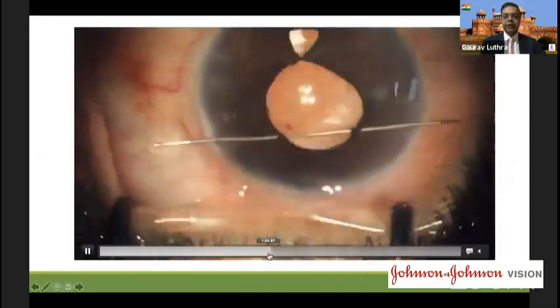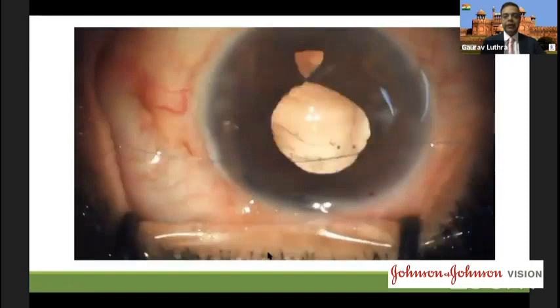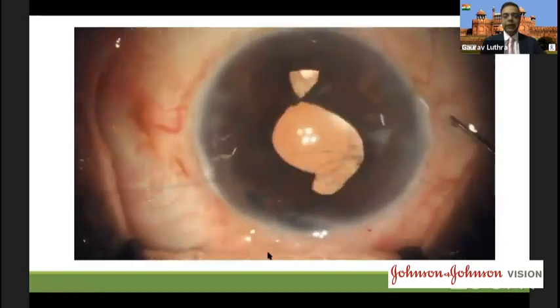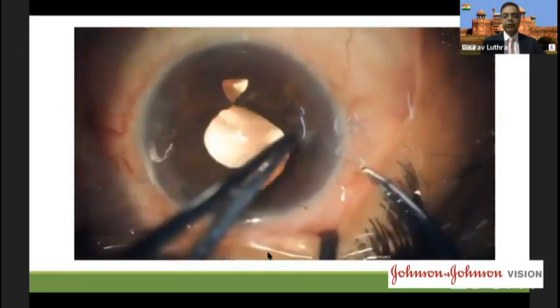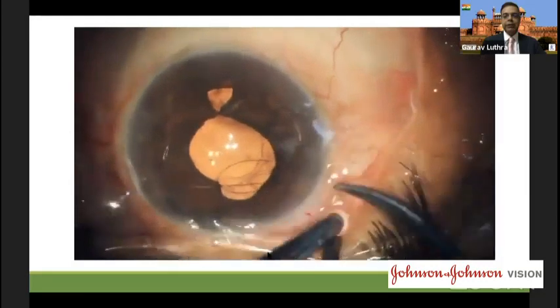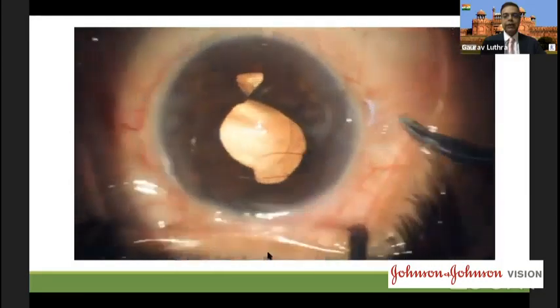We pass it again. Bring it out from the other side's paracentesis, railroad it. Then you pass a slip knot by making the 4 passes, 4 throws, and then that's the loop. And then 1 pass, 2nd pass, 3rd pass, and the 4th pass. And then you just pull the free end on both sides and your knot is there.